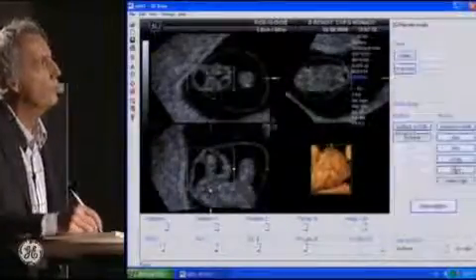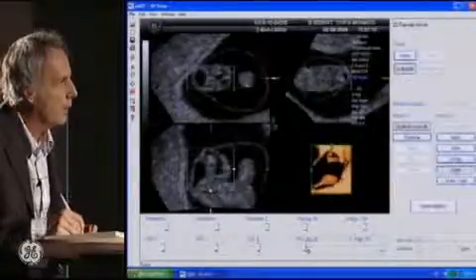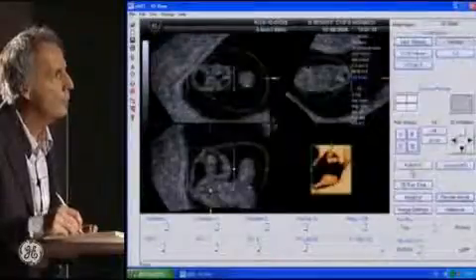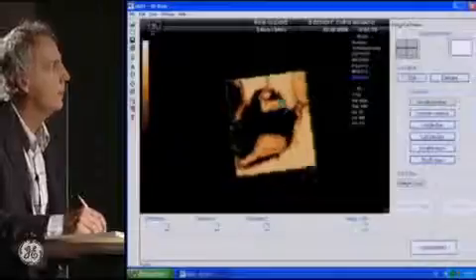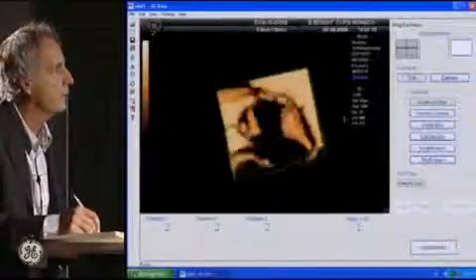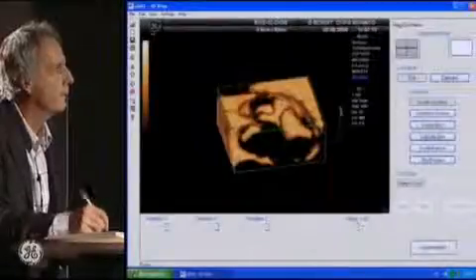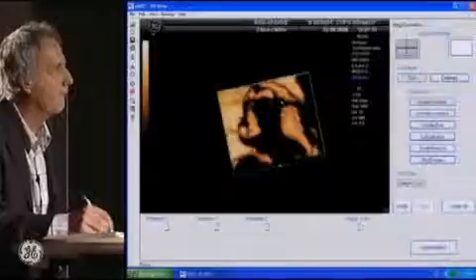And random mode, inversion mode. I increase the threshold. And now I will use the magic cut, full window. And what you have to do is to cut this part. Here again.